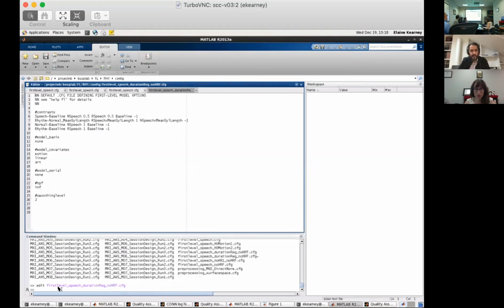In your case, since those are always constant, even though they are 11 seconds apart, the problem with high pass filtering is that it's going to remove many of the things that are interesting, because there is such a long sampling period. So in this case, I would probably set it to inf as well, just to remove high pass filtering altogether. Even if the effect you care about is very much low frequency, you still want to keep it, because that's the nature of your data. So set high pass filtering equal to inf, something like that, to avoid any sort of high pass filtering.